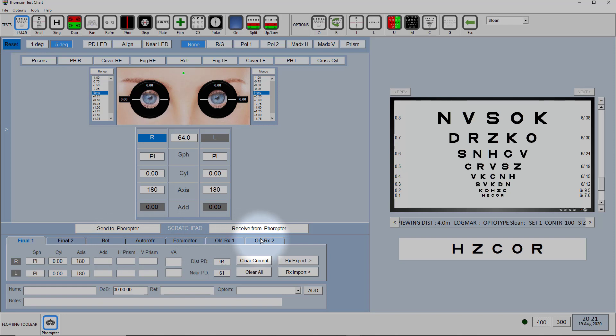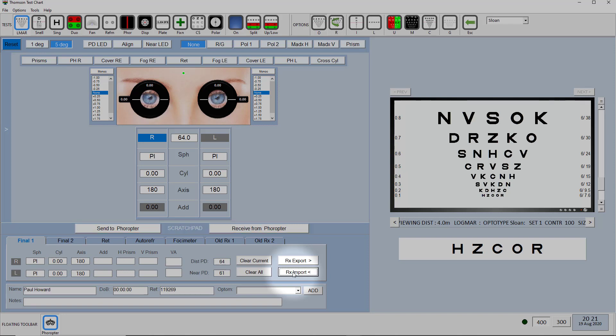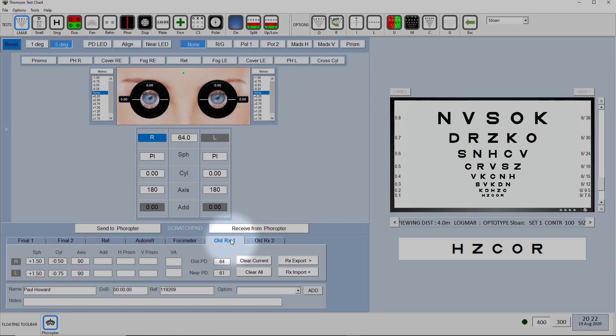To import a prescription once you've got that intermediate file setup, then within your patient management system there will be a button which says export prescription. So you click on that when you've got the patient's record showing and then when you click on RX import here it will read in that prescription and it would generally read in the old prescription in one of these fields either old RX 1 or 2 or phoropter.